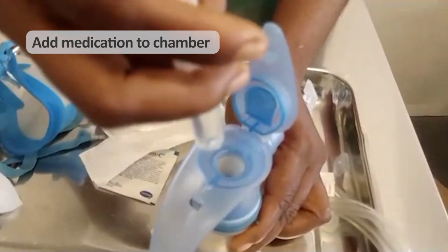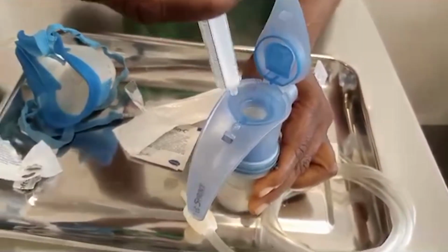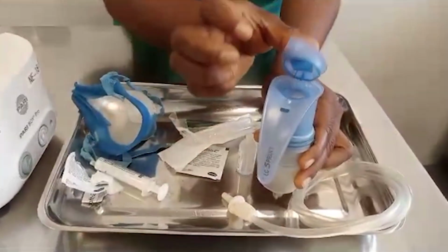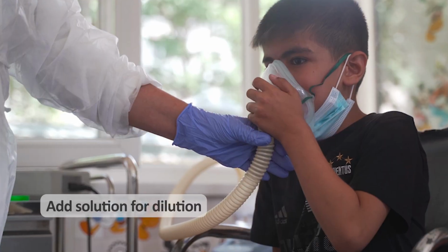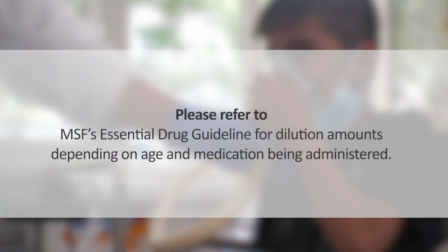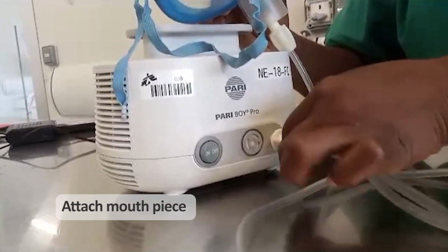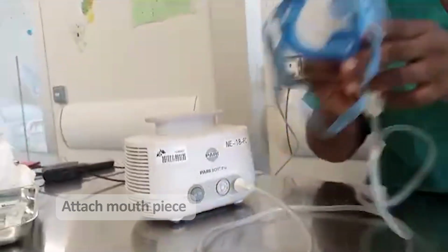Volumes of nebulizer solution to be administered are often insufficient to obtain efficient nebulization in most nebulizers. Diluting the medication increases the volume nebulized, thus increasing medication output and the duration of the nebulization. Please refer to MSF's Essential Drug Guidelines for dilution amounts depending on age and medication being administered. Attach the mouthpiece or face mask via the tubing to the air compressor.